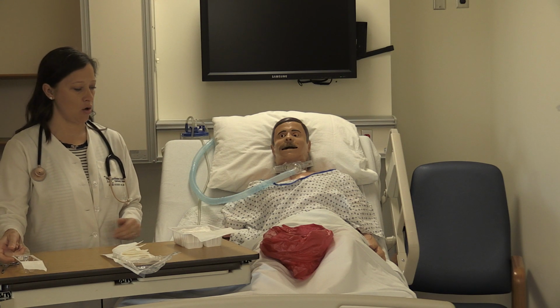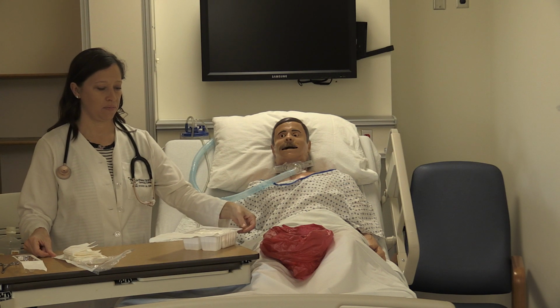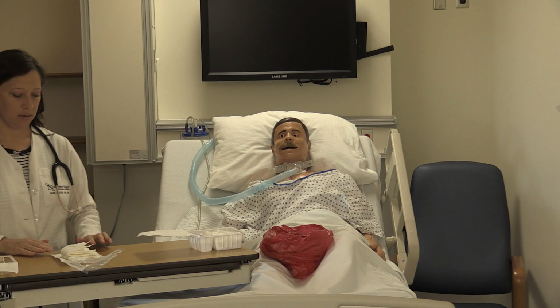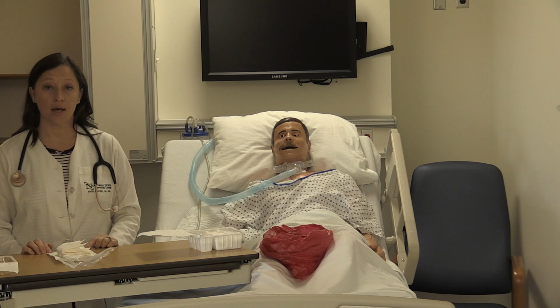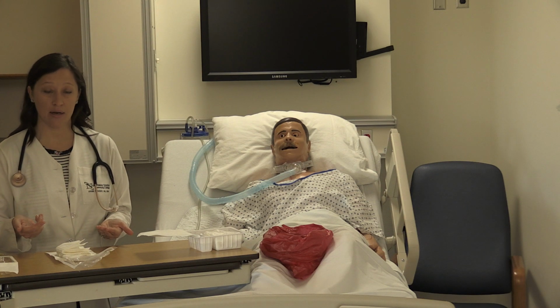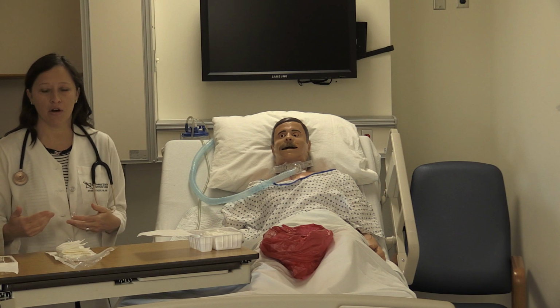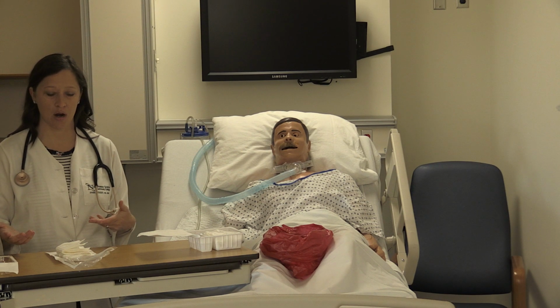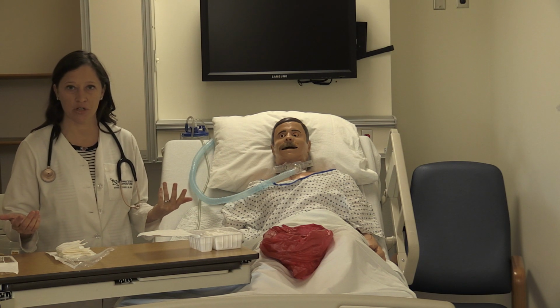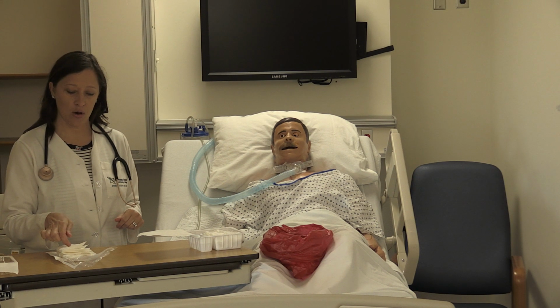Alright, so we are going to now open up my suction tubing, which I did. Some suction tubings come with a drape. If you open your tubing and you see that it has a sterile drape, go ahead and utilize it. Some suction tubings, you open the kit and there is not a drape in there. If there's not a drape in there, that's not a make or break anything. Don't panic about it, you just don't have one to use. Or if you do want to use one, then just have one nearby. I'm just going to go ahead and pick this up.